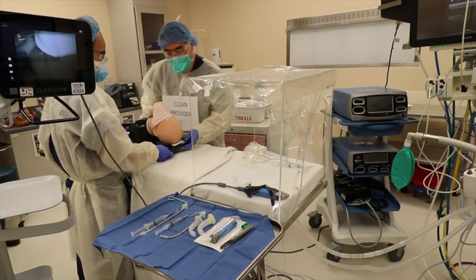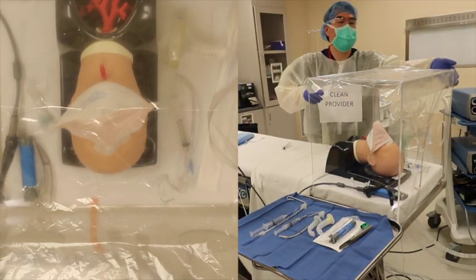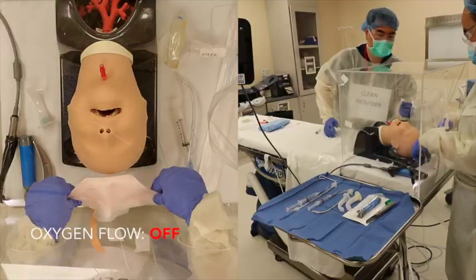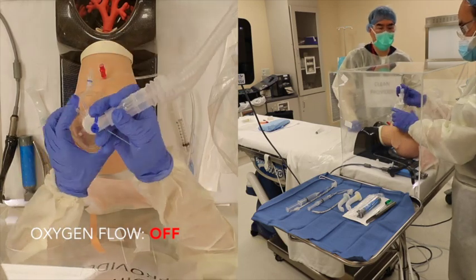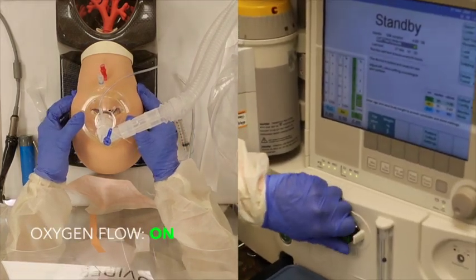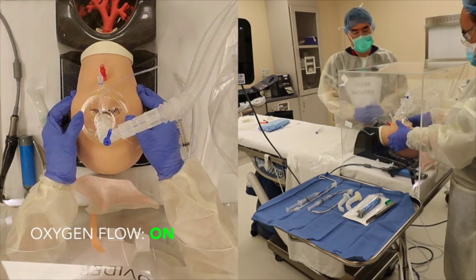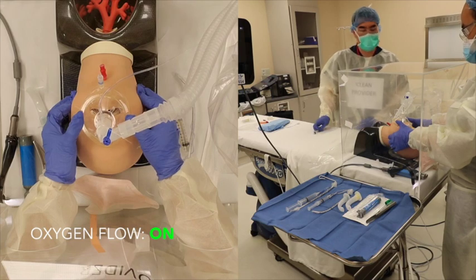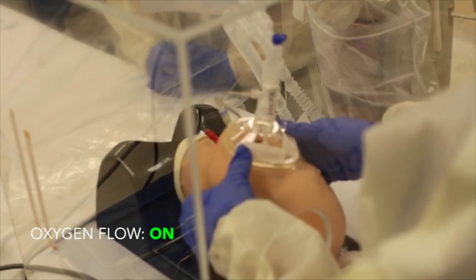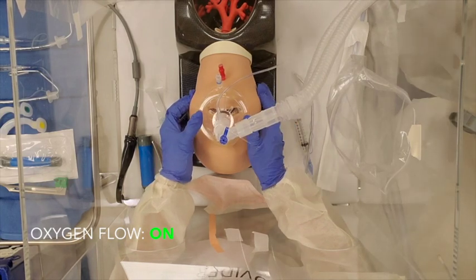Once the patient is adequately sedated, slide the patient into the airway box. The operator will then place the mask over the patient's face. The assistant will then turn up oxygen flows and begin to pre-oxygenate until end-tidal oxygen levels are at least 90%. During induction, minimize mask ventilation — a rapid sequence intubation is preferred. The mask should be held with two hands to maximize the seal.